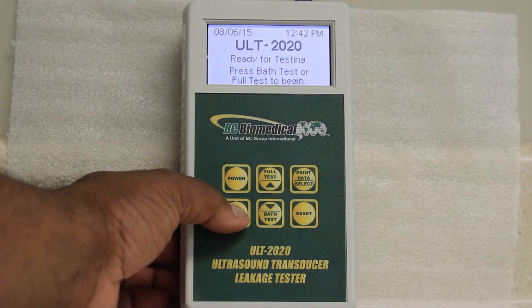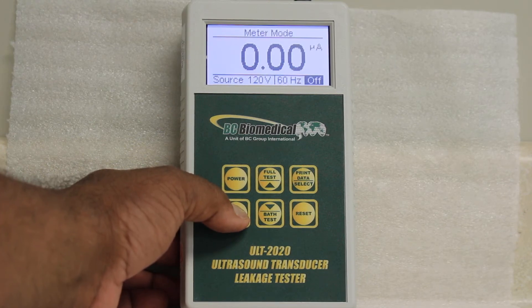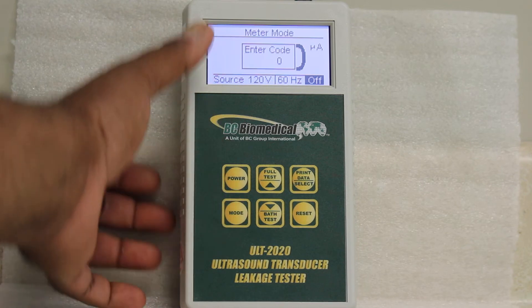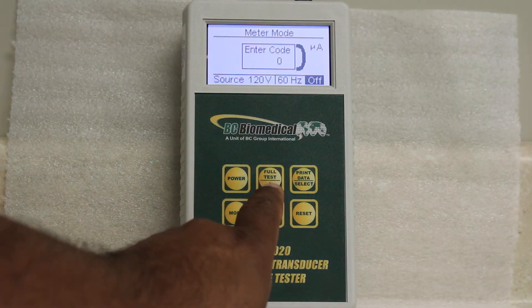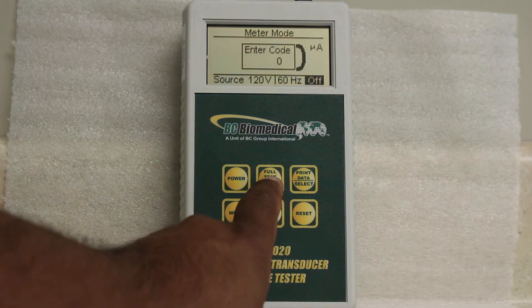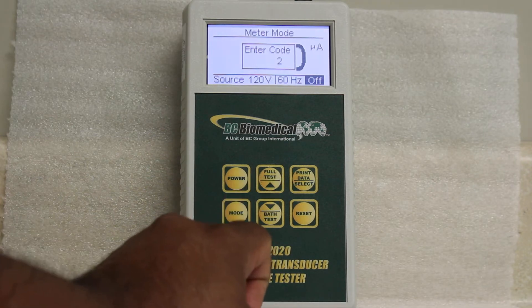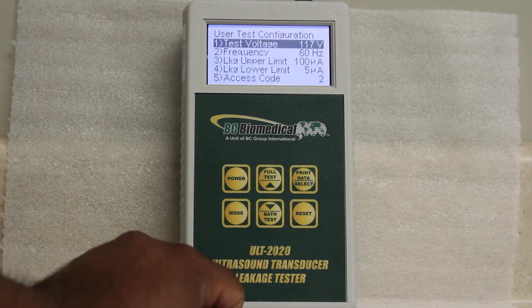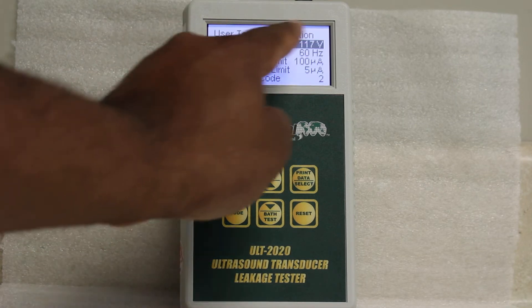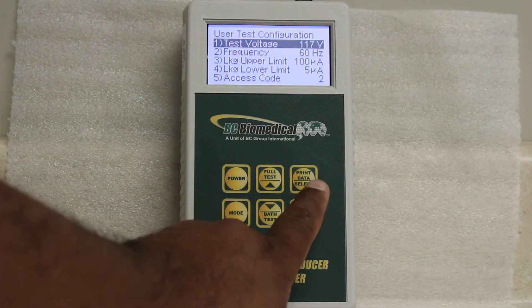Then you hold the mode button down for 5 seconds. When prompted to enter a code, you press the up button twice, and then you press the mode button again and it gets you into the user test configuration menu.